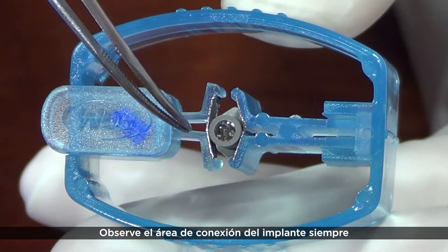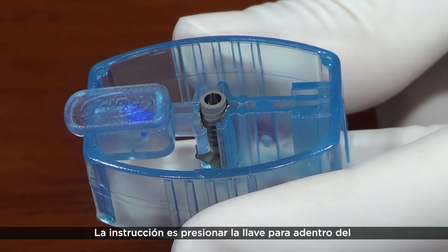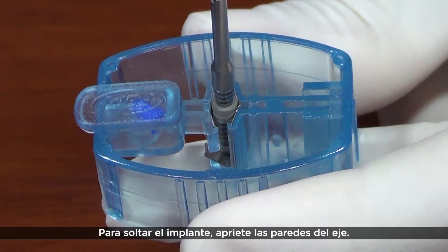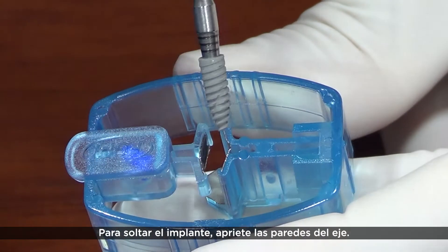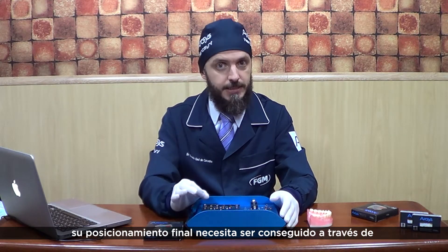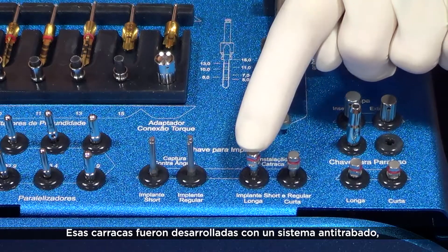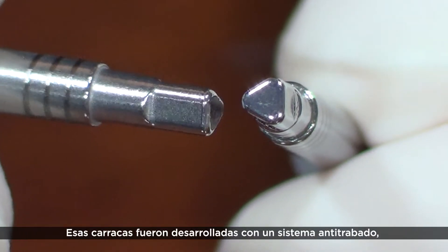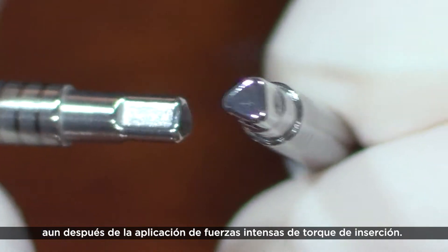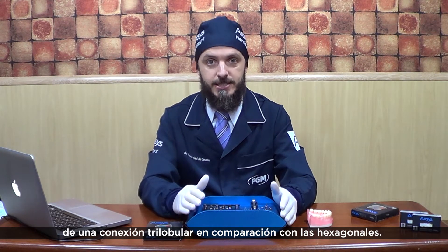Observe the implant connection area, always available for easy driver adaptation. Press the driver into the implant to get a safe connection. For implant release, press the lateral walls. In case of high initial implant stability, its final placement must be achieved by the wrench drivers located in this tray position. These drivers were developed with an end-lock system, so their removal is very easy and safe, even after application of high insertion torque forces. We emphasize the advantages of a 3-lobular connection compared to hexagonal ones.